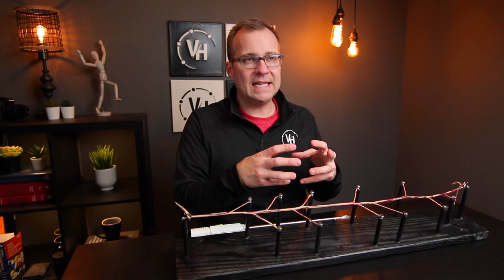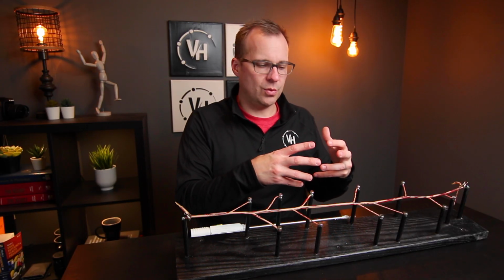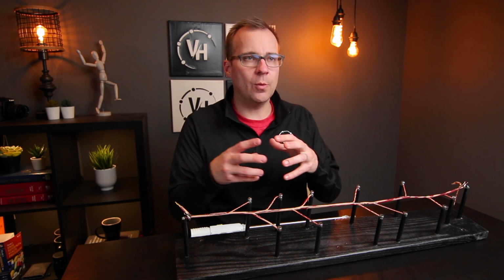So another common mistake that new harvesters make is under dissection at the knee. We are excited to get the scope in there. We make our incision, we cauterize down. We might open up a little bit of a pocket with our scissors, and then we get our scope in there. We start dissecting.